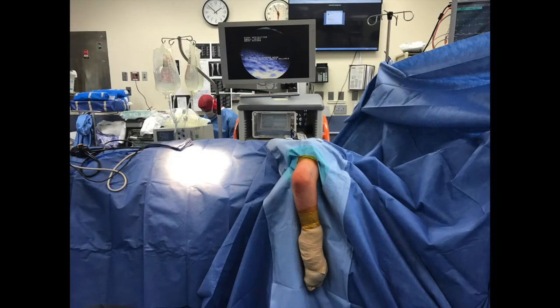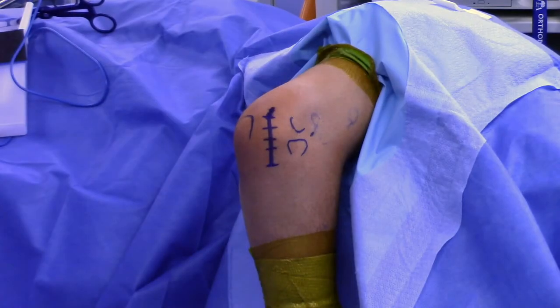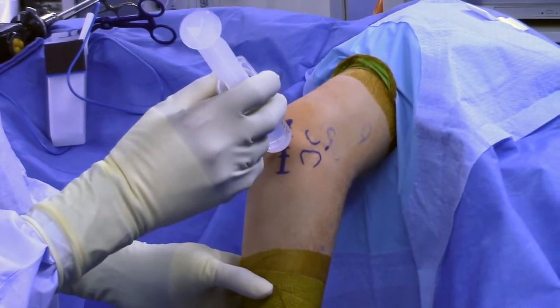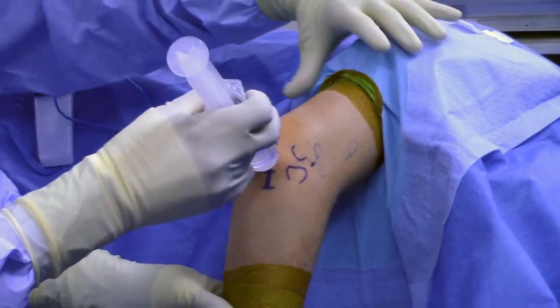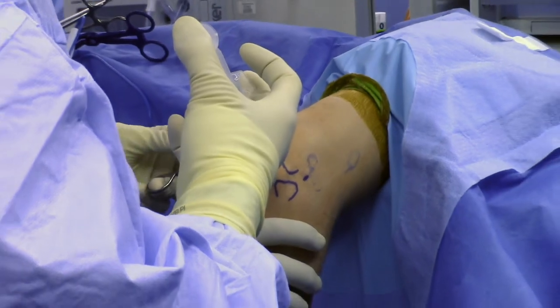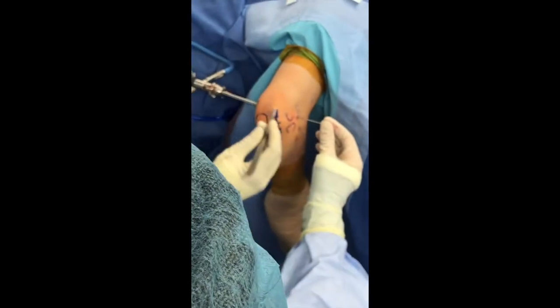The procedure begins with the patient positioned in the lateral decubitus position with the arm on an elbow arthroscopy arm holder. The anatomy is outlined, and a planned incision is made midway between the lateral epicondyle and the ulna.